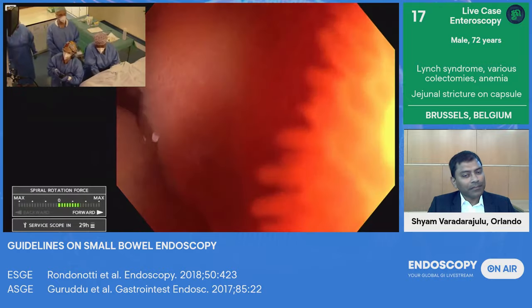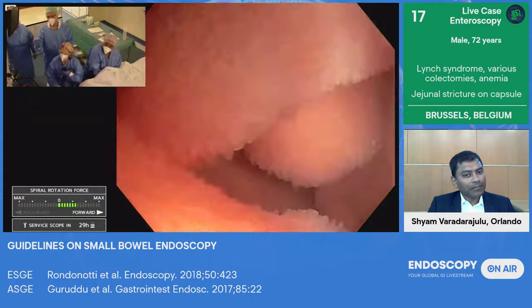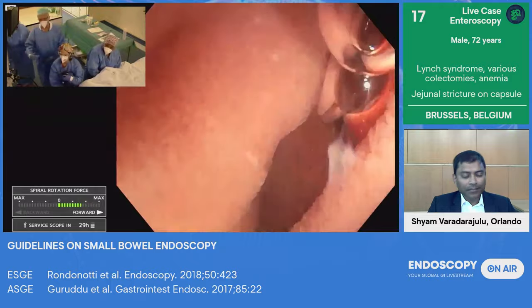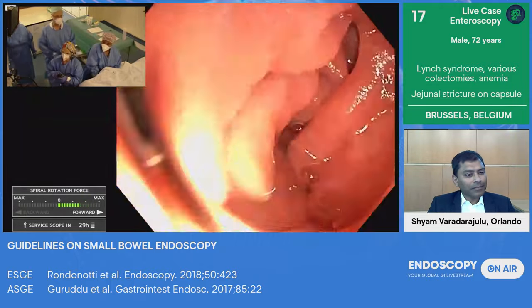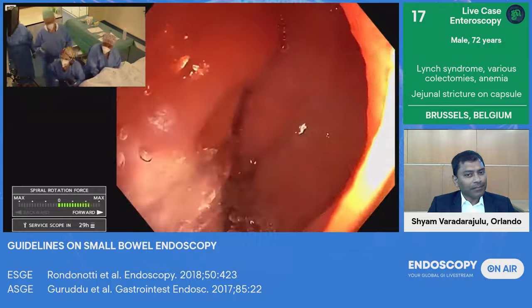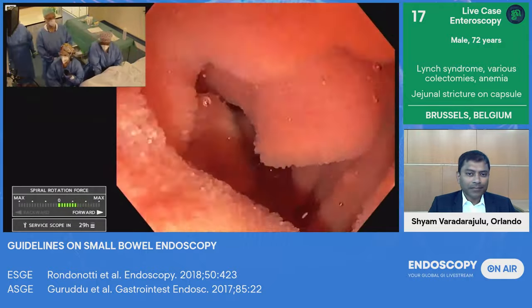And unlike the double balloon, when you pull back, it's really rare to have the scope coming back for 50 centimeters in one spot, and then you have to go back to examine the segment. And when we are in front of a lesion, we can, of course, play a little bit with the spiral, advance a little bit and come back, to increase the stability.